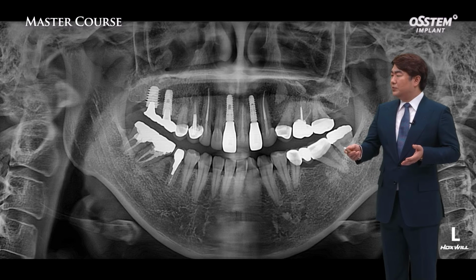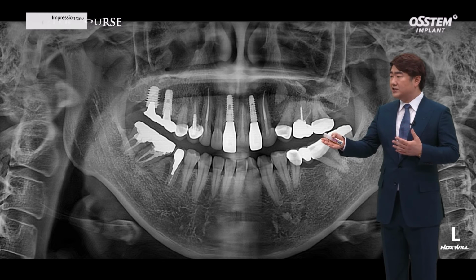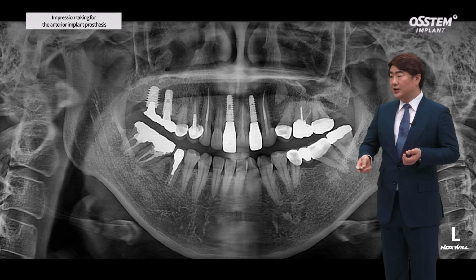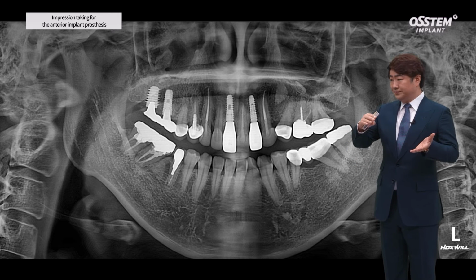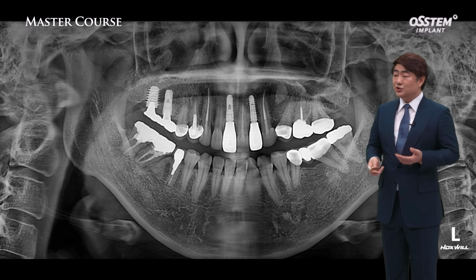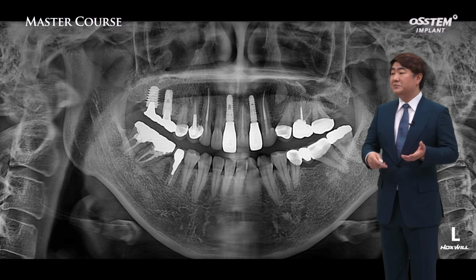And after delivery, as you can see in number 22, the gingiva margin, compared to the initial visit, seems to have quite collapsed. And even number 11 seems to have a bit of a collapse compared to the adjacent teeth. You see a bit of a recession, but number 22 is more collapsed.